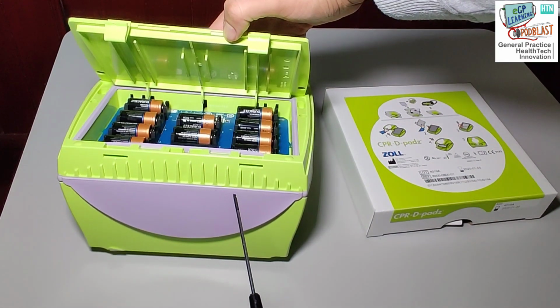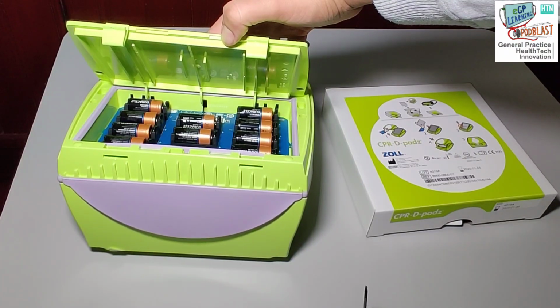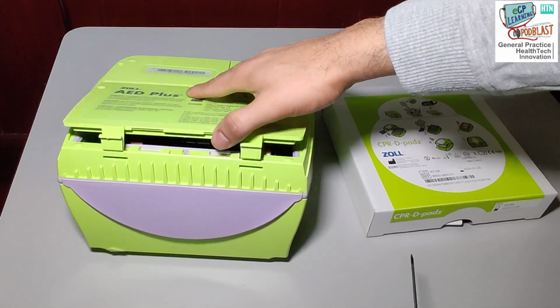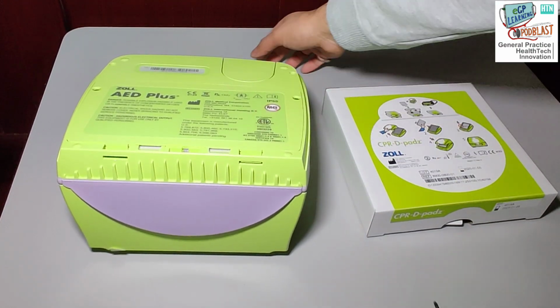As you can see, I've already installed the batteries. This takes lithium 123 batteries, requires 10 of them in order for the device to work, and these should come in your package. Once you've placed the batteries, simply close the lid. And we're done. Then flip the machine back over.